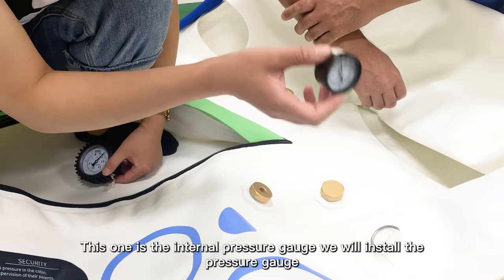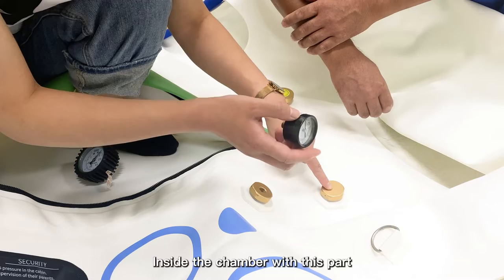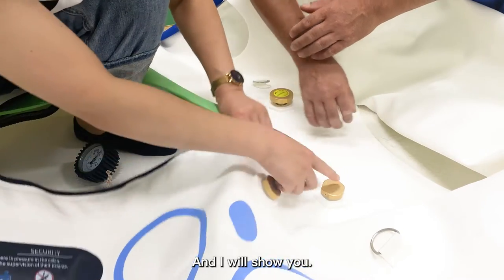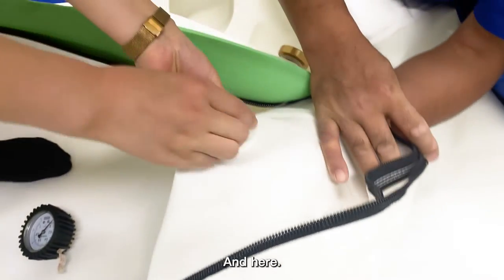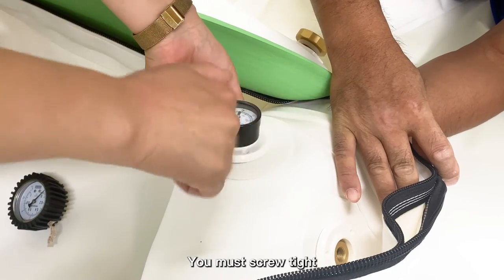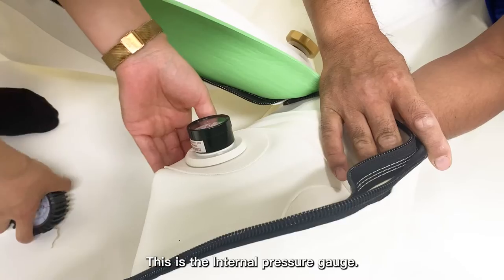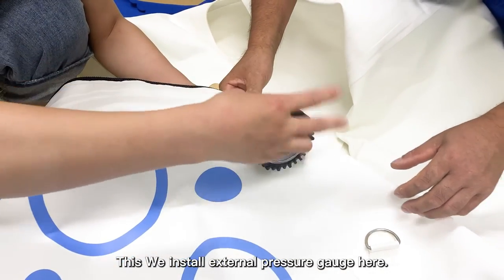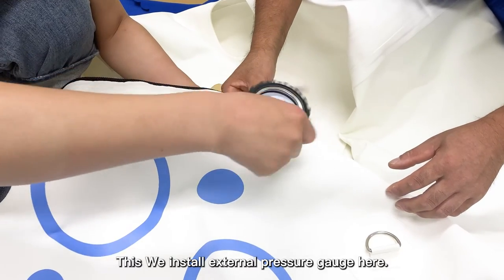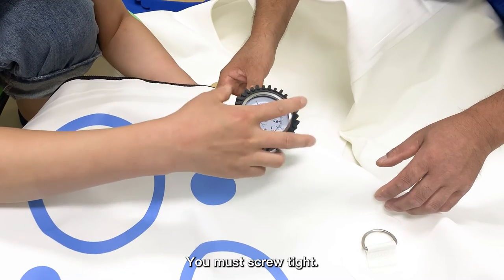This is the internal pressure gauge. We will install it inside the chamber with this part. Screw it tight. Then we install the external pressure gauge here, and you must also press and screw tight.